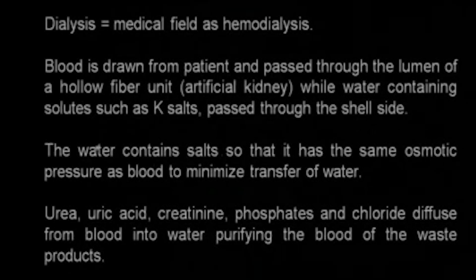Why do you add salts to the water? So that it will also have the same osmotic pressure as the blood. Otherwise, water will start flowing into the blood. You do not want that to happen, understand. That is why you do not just pass water on the outer side of the fibrous membrane, you also have salts so that the osmotic pressure is balanced and there is no water ingress into the blood.